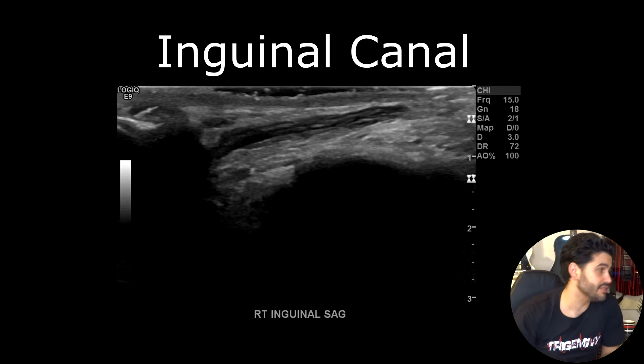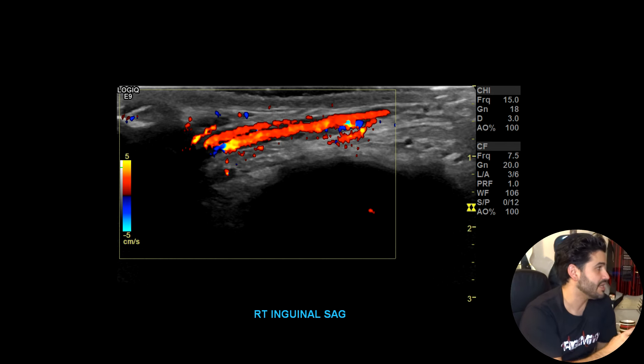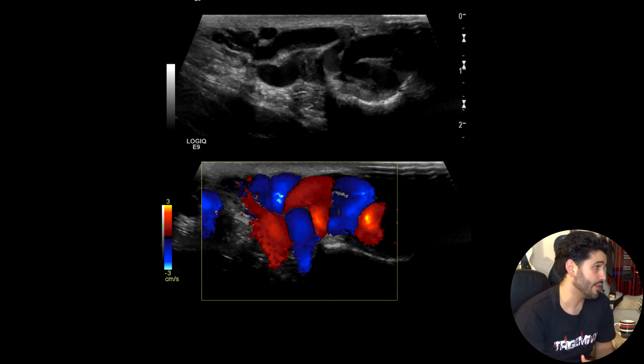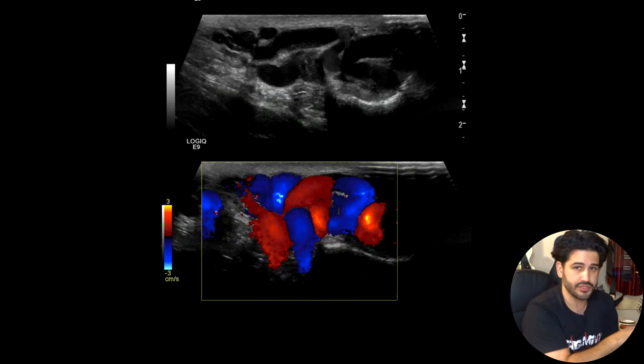Once you're done with the testicular images, you want to go into the inguinal canal. There you're going to look for the spermatic cord, making sure there are no inflammatory changes like funiculitis. Put color doppler there — you can see the spermatic cord vessels: the arteries and the smaller veins of the pampiniform plexus. You also want to check for varicocele. A varicocele can be within the spermatic cord or can track all the way down into the hemiscrotum. You'll see a lot of anechoic tubes — longitudinal in sagittal, circular in transverse.